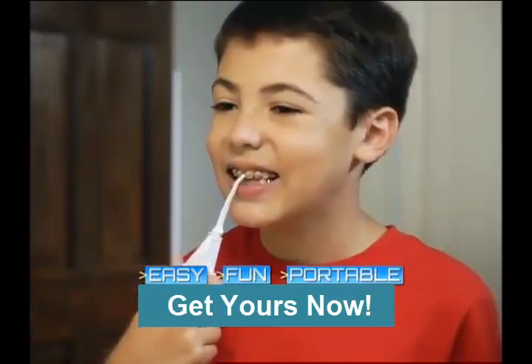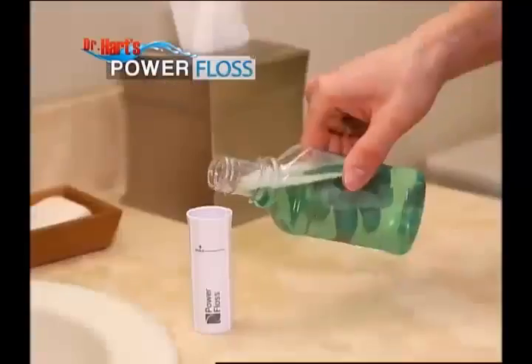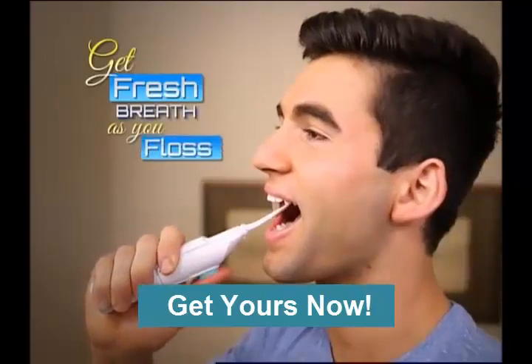Little ones love Power Floss because it's so easy and fun to use, and that means better checkups. You can even fill Power Floss with your favorite mouthwash to get fresh breath as you floss.